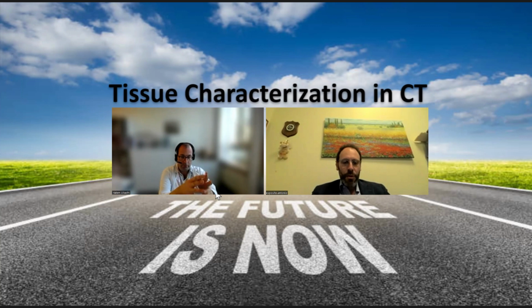What is very important is that it is impossible in obese patients. Absolutely. So in really obese patients, in patients with a BMI larger than 35, 36, absolutely I exclude performing the delayed enhancement, in particular in the emergency department.